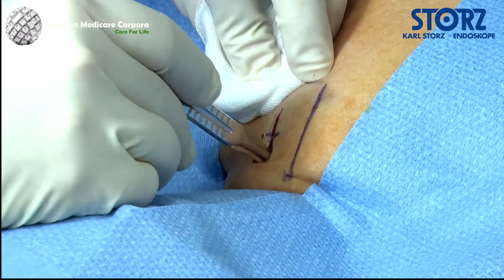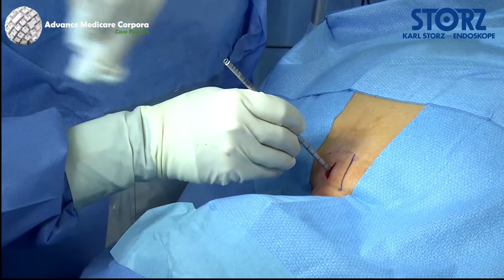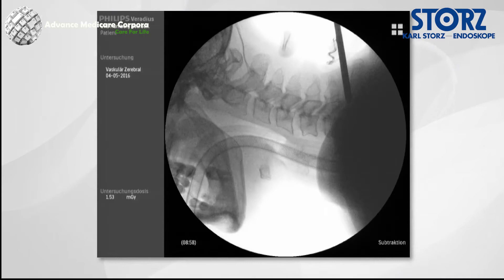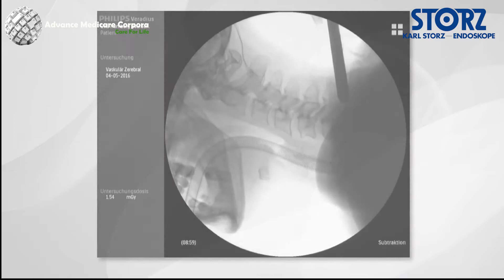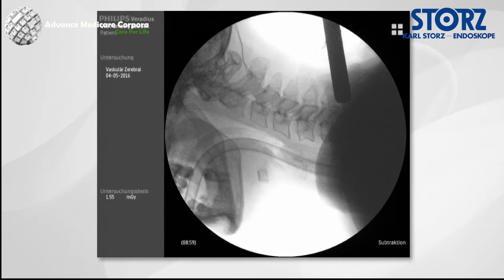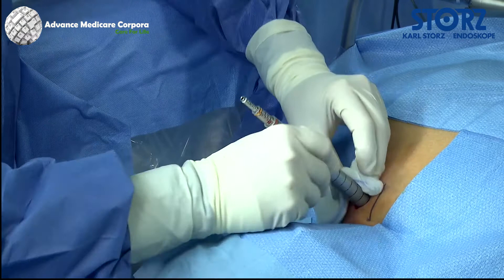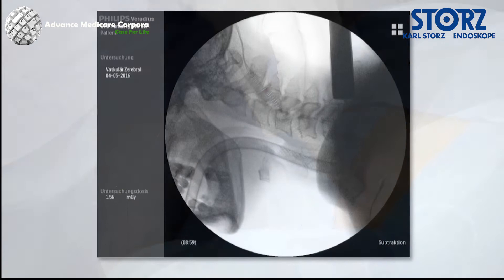Depending on the size of the trocar, a skin incision between 0.8 and 1.8 centimeters is required. The neck muscles are retracted through sequential insertion of various dilators. If the green trocar is used, then dilation is performed with the corresponding green dilation sleeves. To ensure an ideal surgical approach, it is important that bony contact to the dilation sleeve and the lamina can be viewed during dilation.